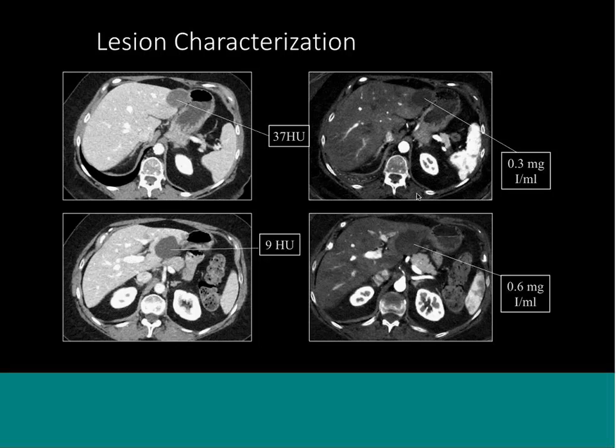It could be a biliary cystadenoma, which is a pre-malignant lesion. This helps the radiologist more confidently characterize the lesion, and we would spare the anxiety and the patient workup. So there's a theme here.